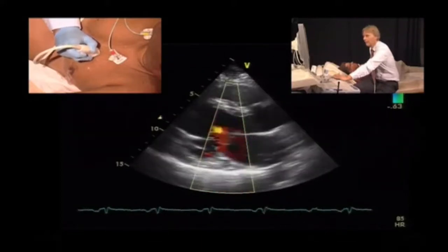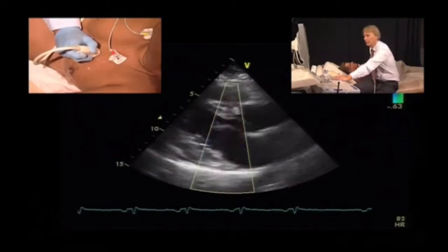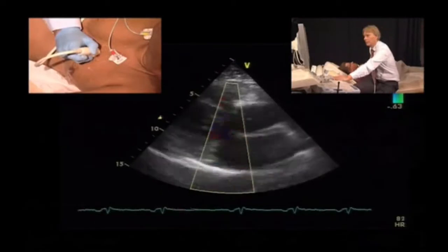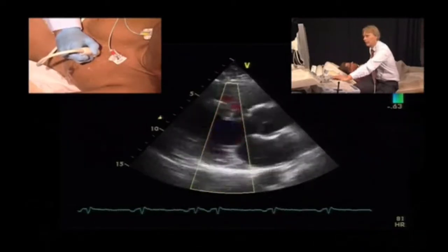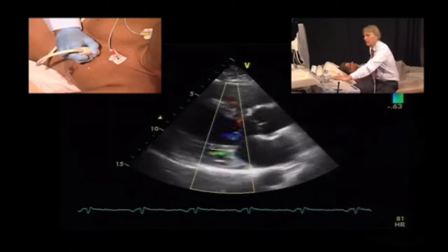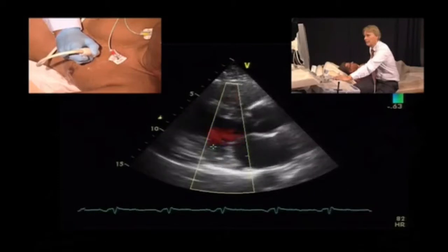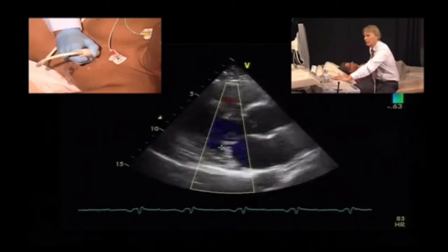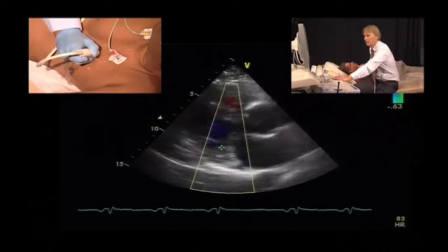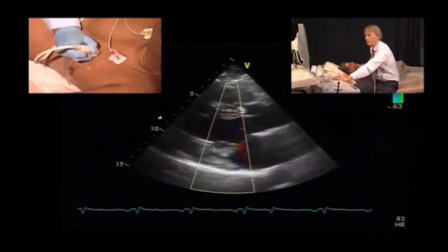But what I would now do is tilt the transducer towards posterior, and while I do so, I will try to see if I can image the proximal portions of the jet, so the origins of the jet. And you can see, I can still see the regurgitant jet here, even in the posterior medial regions of the mitral valve. Okay, now I will move the transducer back.